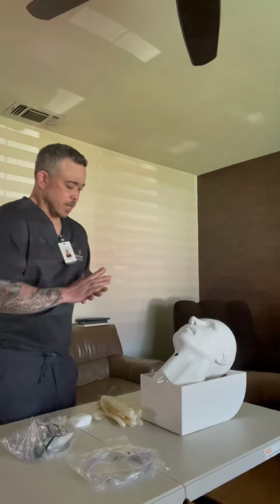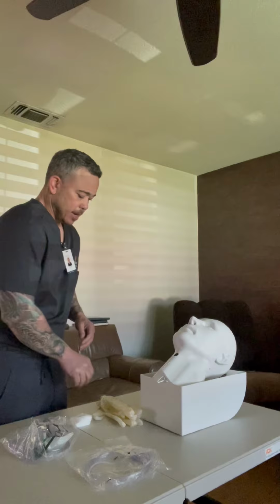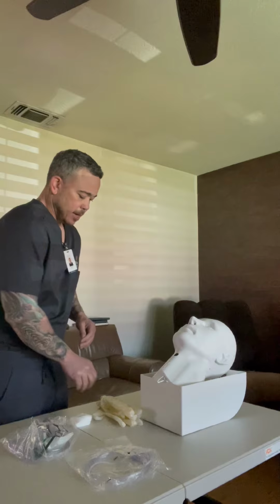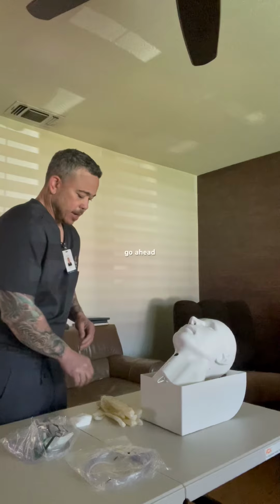So the next thing I'm gonna do is go ahead and put on my gloves. And at any time during this process, if you have any questions, sir, go ahead and ask away. Okay. All right, got my gloves on. I'm gonna go ahead and get my nasal cannula. Okay, so you got the nasal cannula here.